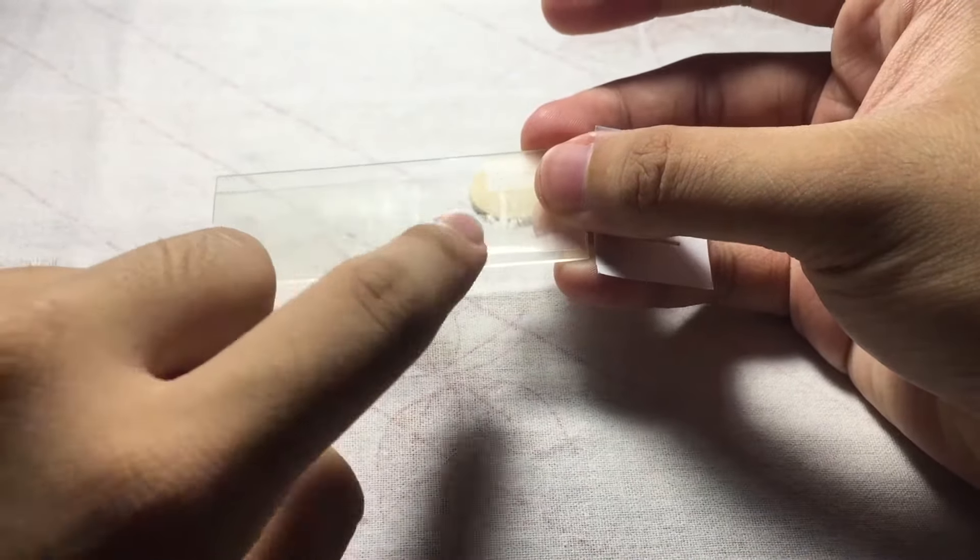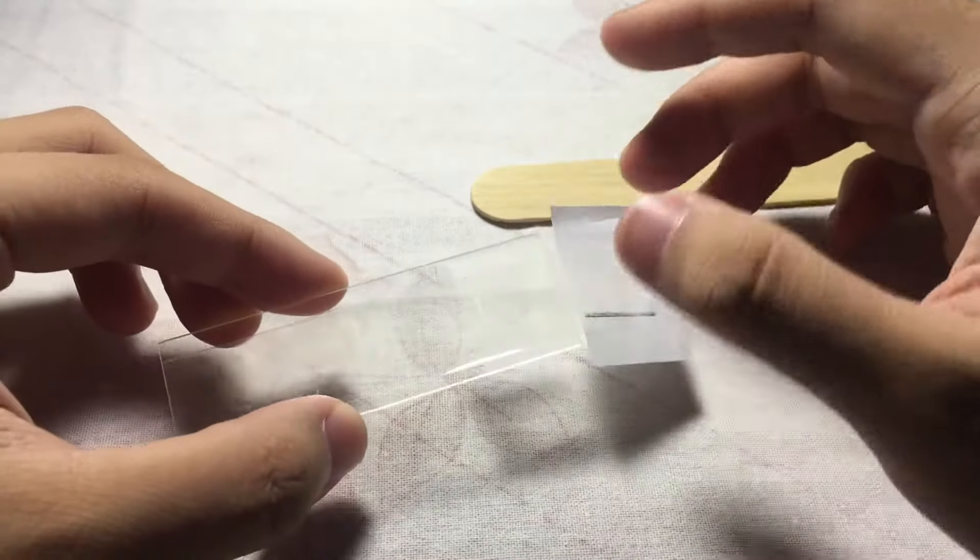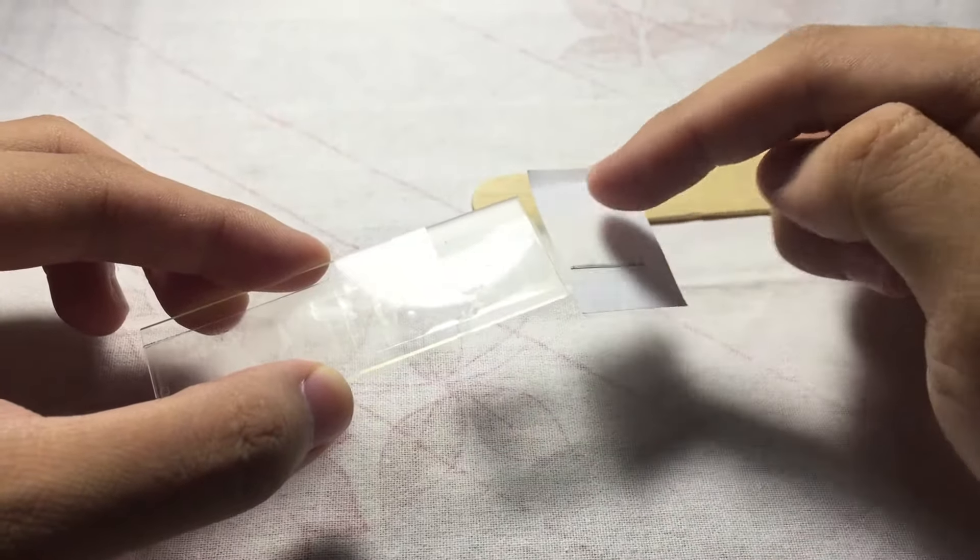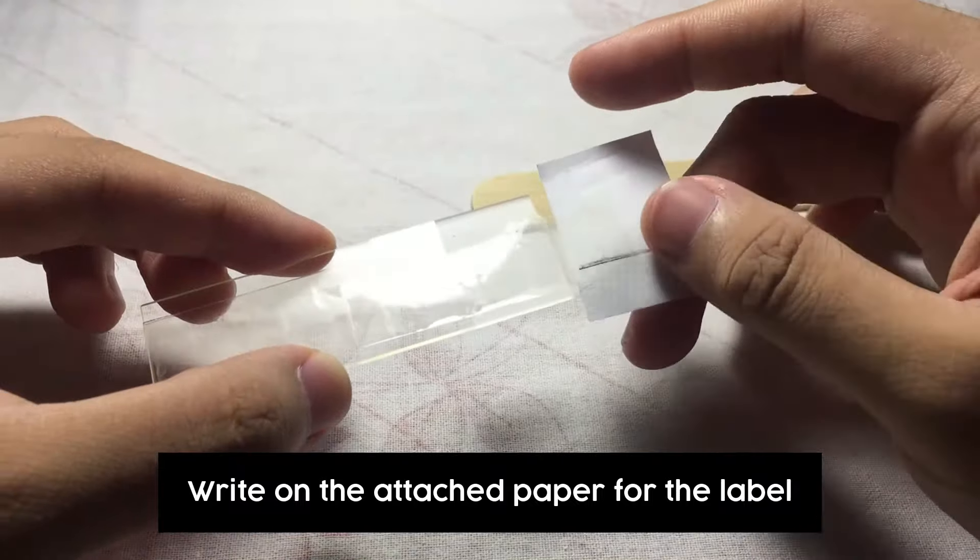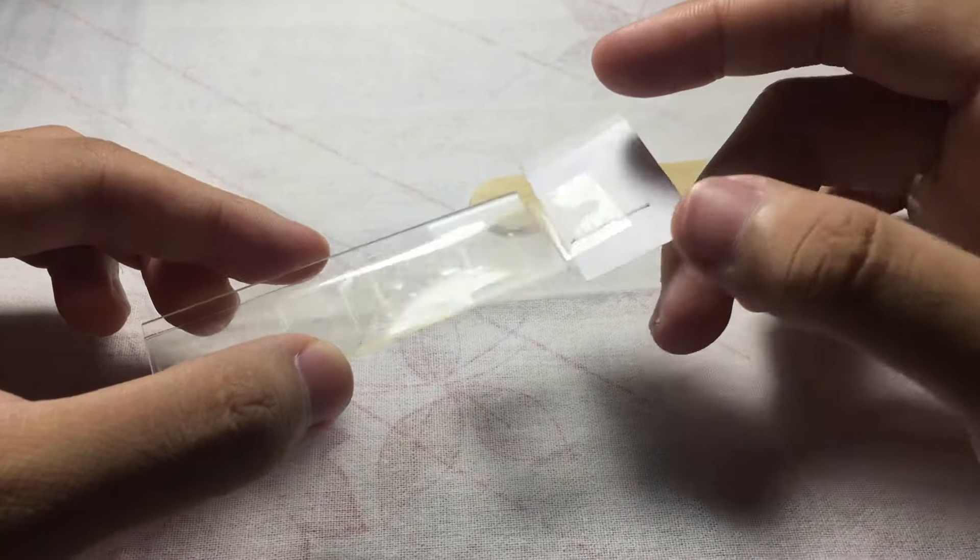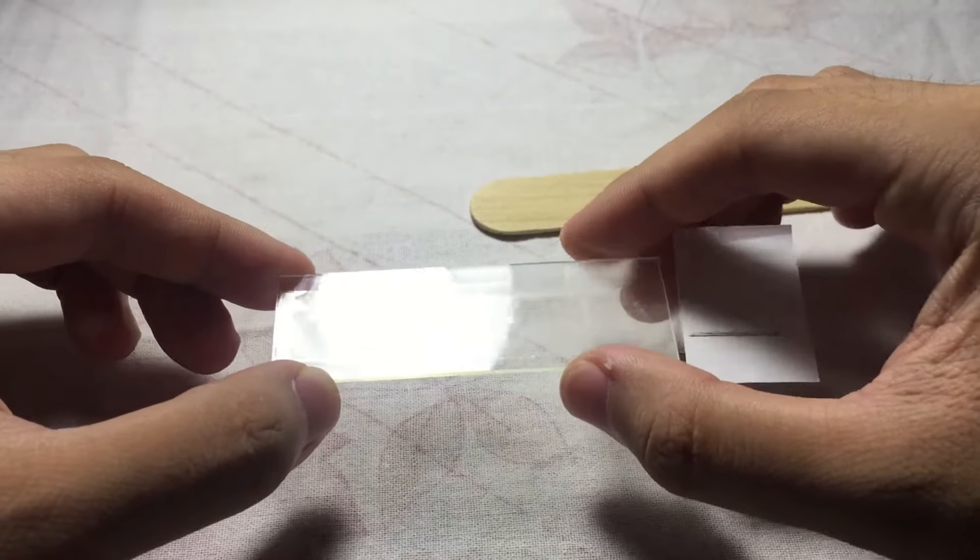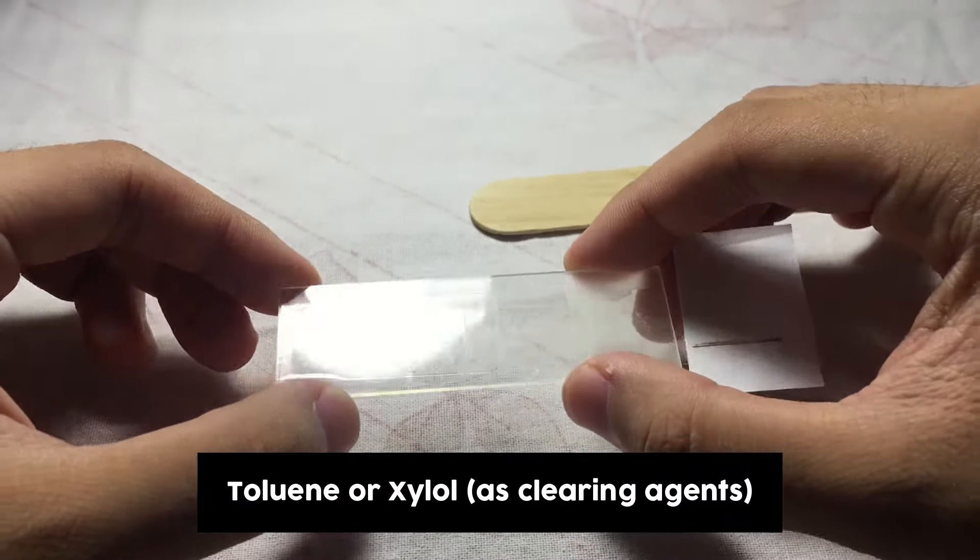Basically that's it. This is now your scotch tape swab where you examine. This is where your eggs are located. You examine under the LPO of the microscope. Do not forget after getting your sample to label the slide with the name of the patient, birthday if available, and other important information.